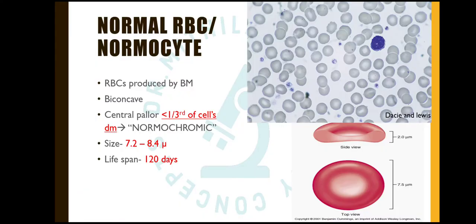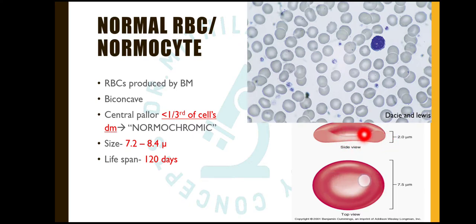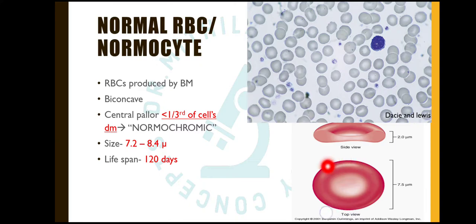Next we come to a normal RBC, also known as a normocyte. RBCs produced by the bone marrow are biconcave. In the side profile we can see depressions in the center and a bulge in the periphery — so in the center it is depressed and in the periphery it is bulged. This is a biconcave shape.